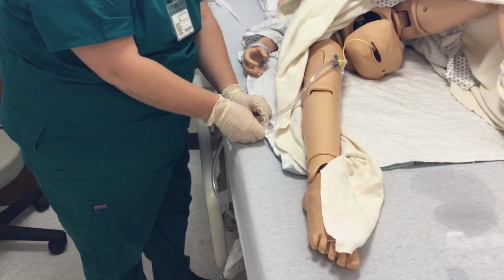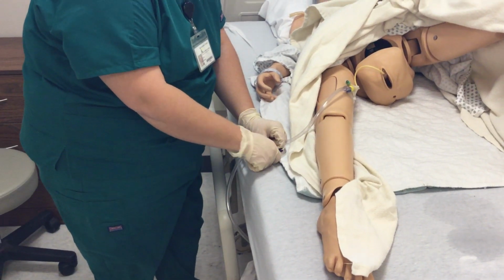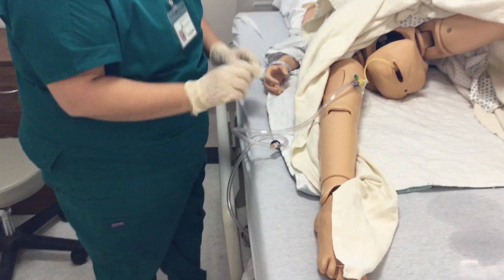I want to coil the excess tubing up and then clip that on the bed.